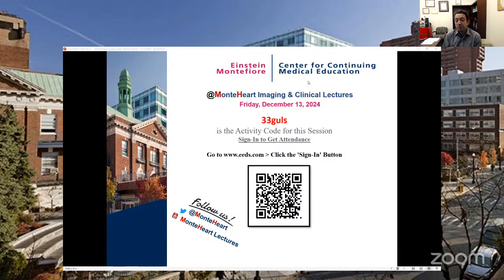And then if it is to bring the patient back next week or next month, then it's the same hassle or work as doing any other perfusion test. And there's data to support that probably PET and MRI are a little bit better. It's pretty comparable to SPECT, but we're not gaining much by bringing somebody back to CT. And I don't think creating a workflow where it's easy to make sense of it is that simple.